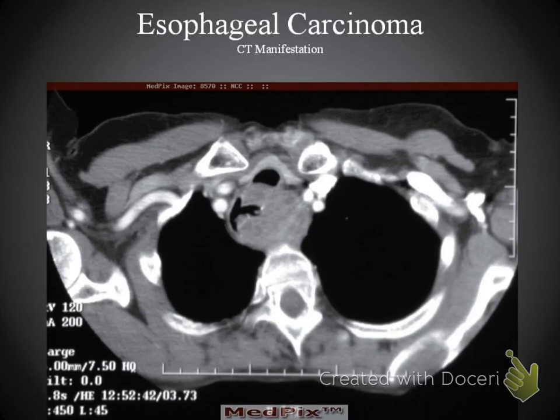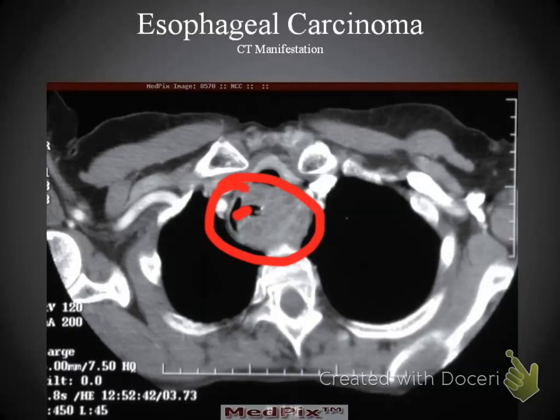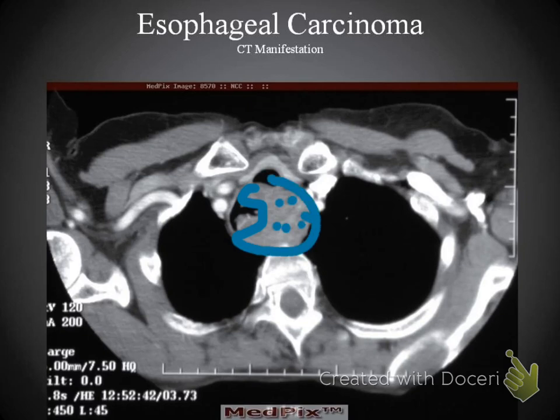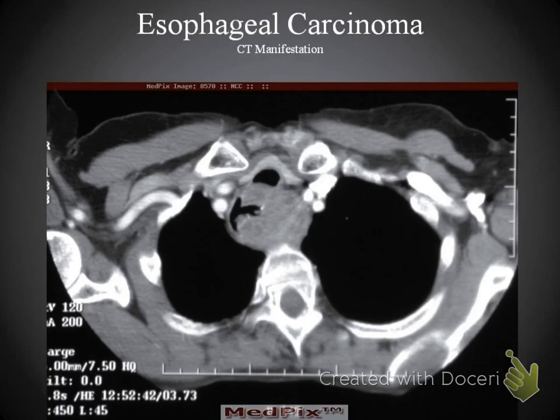This next image is even more concerning. This is the esophagus and the inner lumen, and we see a huge mass surrounding the esophagus. This is very detrimental to the patient's health, probably resulting in a very poor prognosis, and surgical resection is almost unlikely. We also see some contrast enhancement — a speckled appearance — indicating various portions of the tumor have enhanced, showing a great deal of blood flow there. It's highly vascular, and based on all of this, this could be a very poor prognosis for the patient.